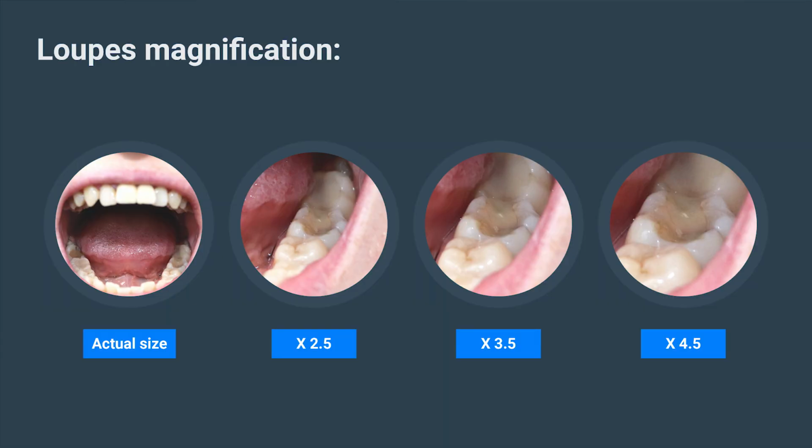If you're tending to do more endodontics in your daily work, then you might want to look at 4 or 4.5 times magnification. At that point, you probably are considering a microscope. Not everybody has £25,000 for a microscope. If they're not doing enough endodontics, then perhaps loupes would be a better idea.